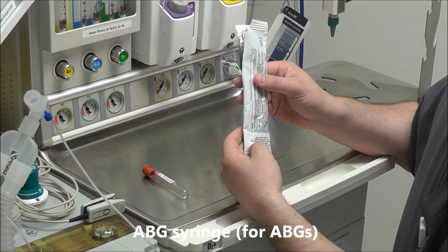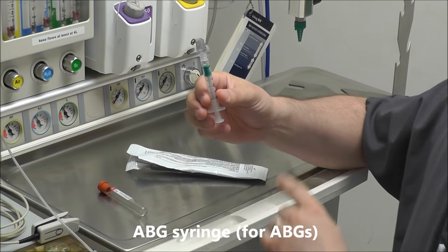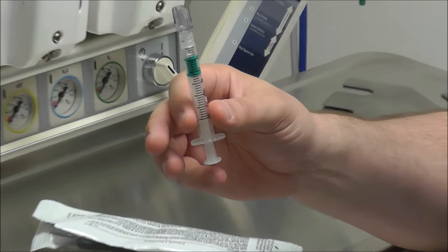If you're just going to draw an ABG, the other option we have is a blood gas syringe. It looks like this. It has 100 units of heparin on the inside.